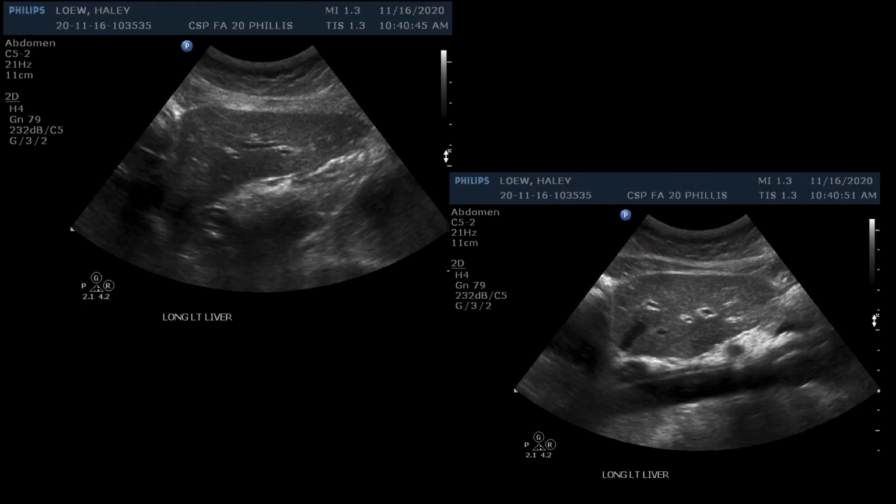The left lobe of the liver is taken at different levels. The lateral and aorta levels are shown here. I swept as lateral as possible for my first image. Also make sure your focus is at the level of the liver and you're not clipping the inferior tip. 2 images may be needed. I could have used TGCs to make my image more homogeneous throughout.